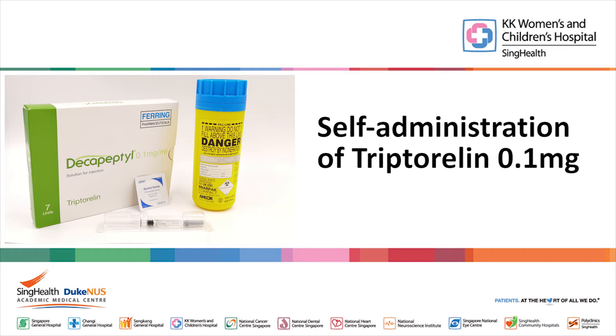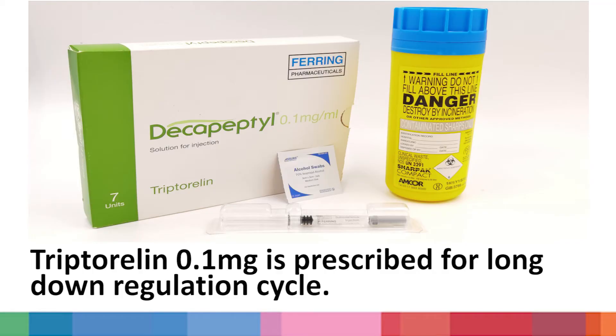The following video will show you how to inject subcutaneous tryptorelin at home. 0.1 mg of tryptorelin is prescribed for long downregulation cycles.